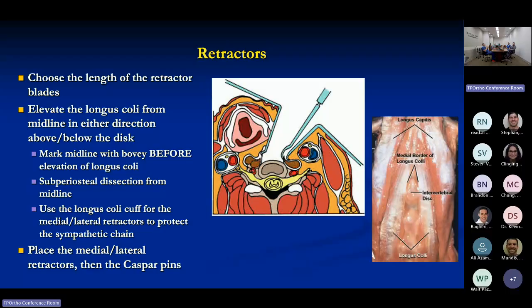There will be cases where people have DISH, a huge amount of bony irregularities that push the longus around and may disturb that symmetry. So if you have that extreme spondylosis or ankylosing kind of conditions, you have to adjust your plan a little bit and be a bit more thoughtful, and then go to deeper anatomy to get a better sense of the midline, and use the uncus as an example on either side. All right.